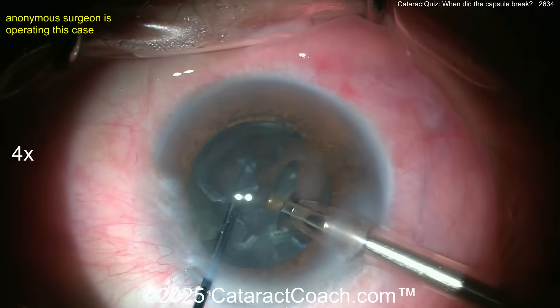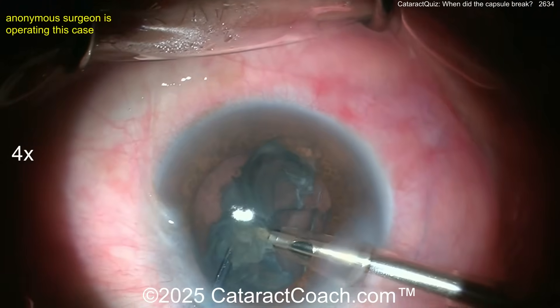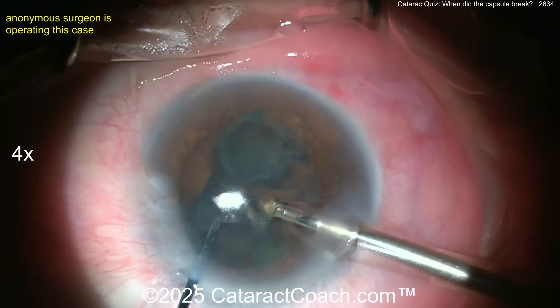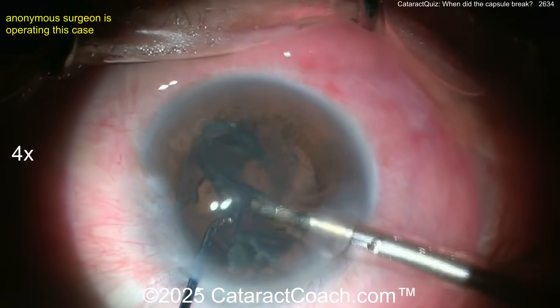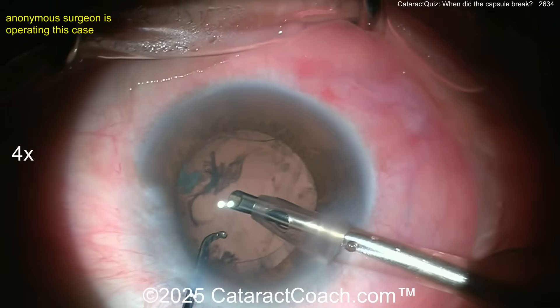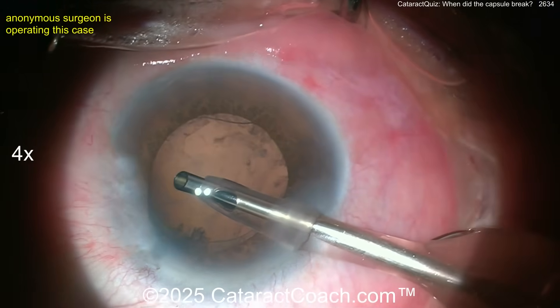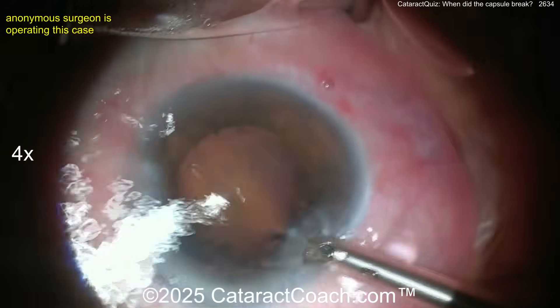Going in here removing the last pieces. You may think everything is normal until — watch this — as these last few pieces come up out of the capsule bag, it may be quite a surprise. Bringing pieces up nice and easy; a little epinuclear shell that just needs a little energy to aspirate down. And look — there it is.